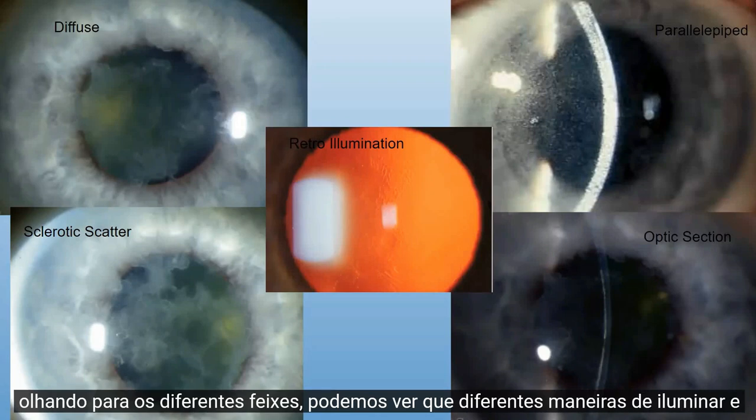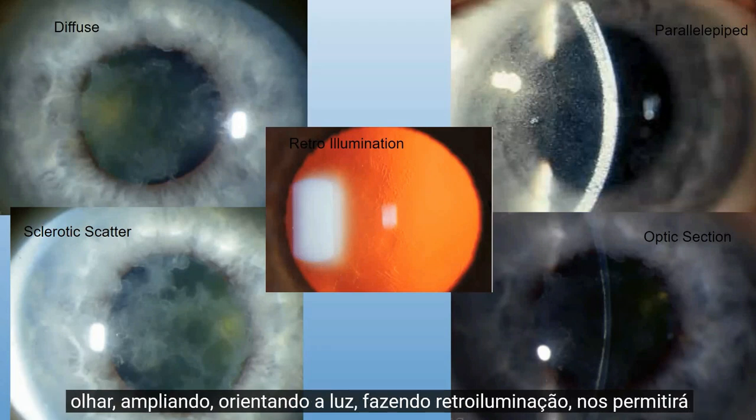So again, looking at the different beams, we can see that different ways of illuminating and looking, magnifying, angling the light, doing retroillumination is going to provide us different views.